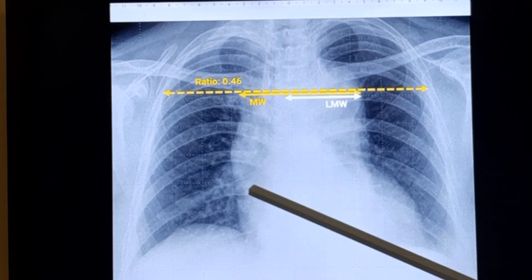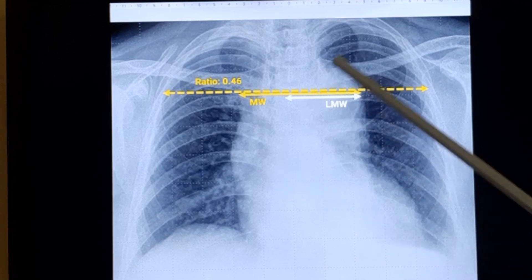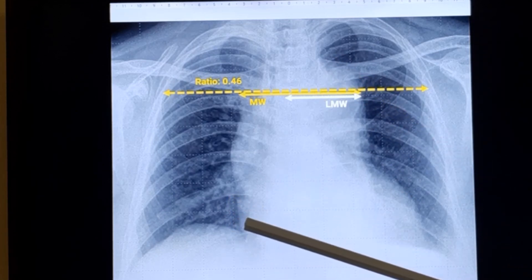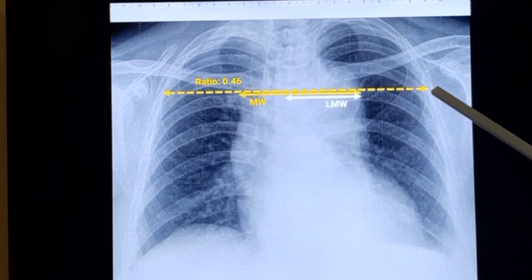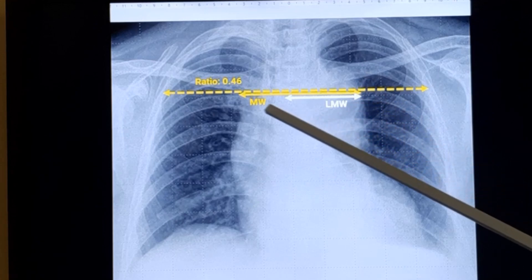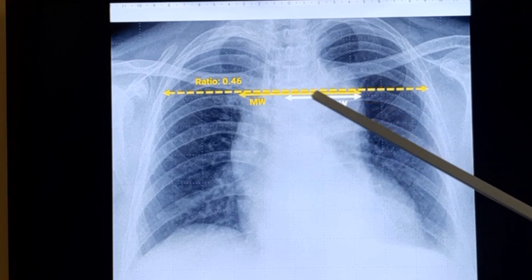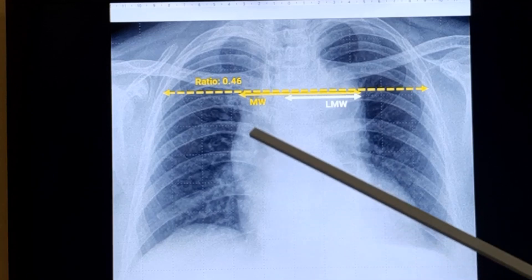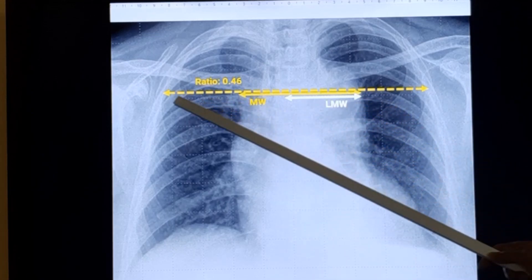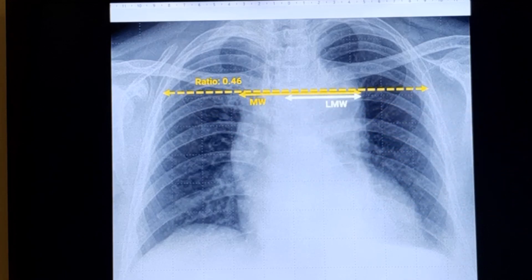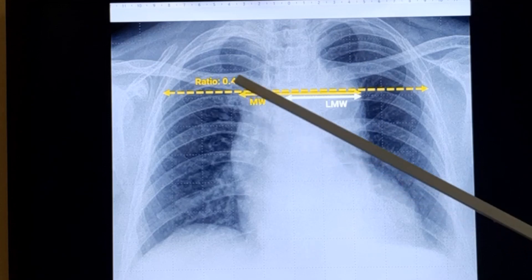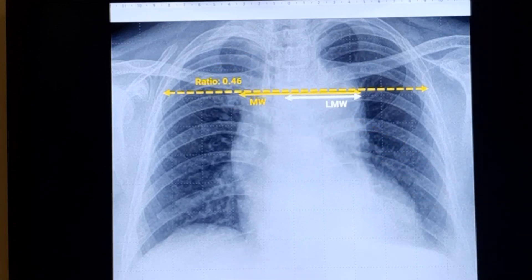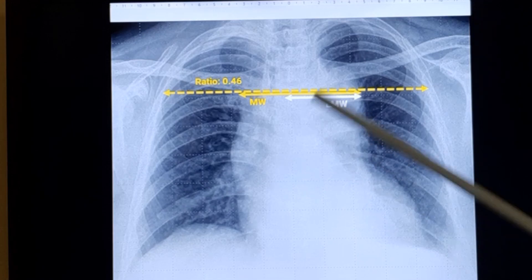When you look at the x-ray, another comparison you can make — since the size of x-ray films may be different — is to take the transverse thoracic diameter at the level of the aortic knob and compare it with the mediastinal width. A mediastinal width more than one-third of the transverse thoracic diameter at the level of the aortic knob will be suggestive. In this case, I measured it using the grid and ruler and found it to be 0.46, so it is definitely more than one-third. This is one way of quantifying.